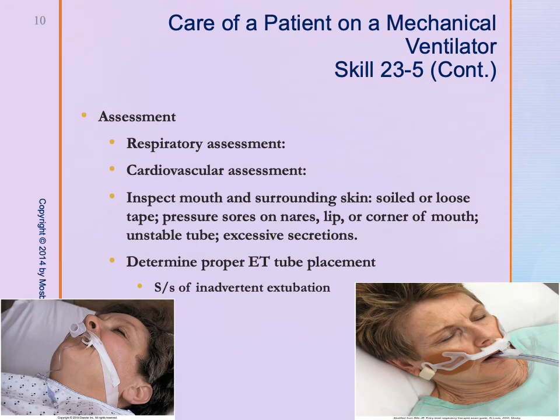Now we will focus on the assessment portion of caring for a patient on a mechanical ventilator. A respiratory assessment is required. This includes respiratory effort, chest rise and fall for symmetry, auscultation of breath sounds, listening for adventitious breath sounds, assessment of oxygen saturation, and counting respirations.